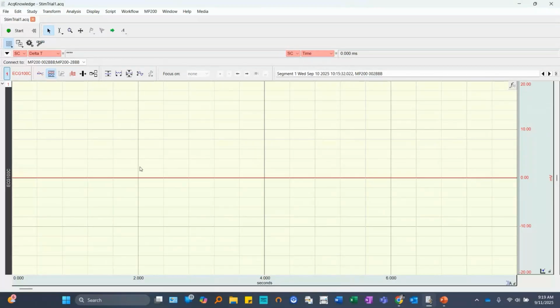So basically, I'll explain what I'm doing here first before I actually build this out. As I just mentioned, we're generally bringing somebody into the lab and running them through a trial that's going to last somewhere in the neighborhood of 15 to 20 minutes, because we're going to present generally in the neighborhood of 30 trials for one overall session. So once they get connected, headphones on and everything, they're going to hear a series of approximately 30 pre-startles and startles, and you're going to record the EMG over that entire period of time.